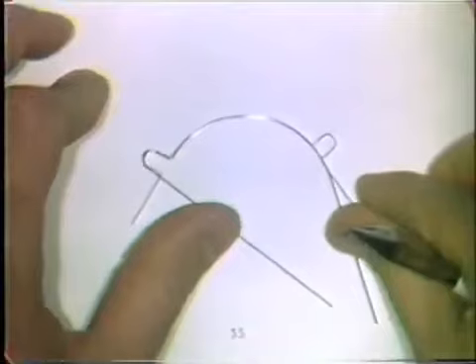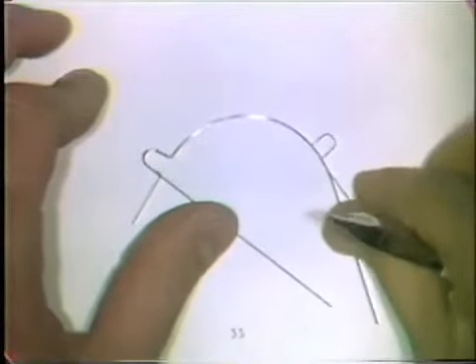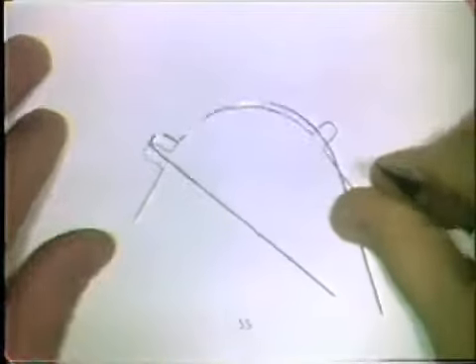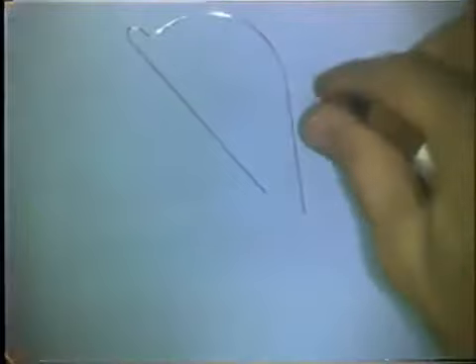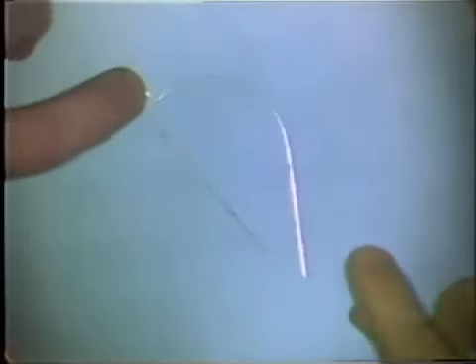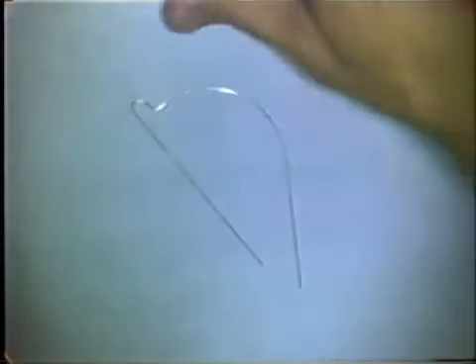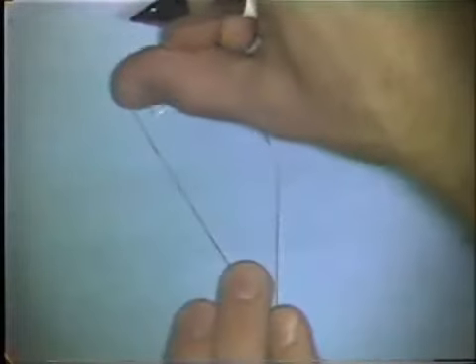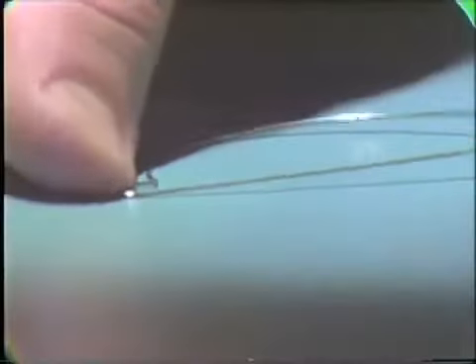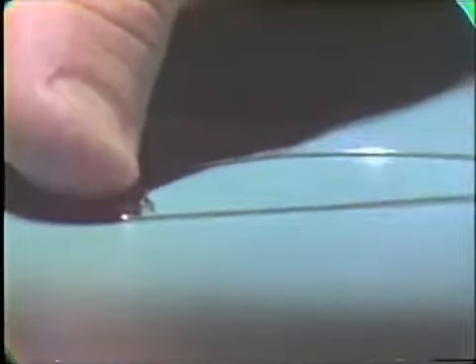Try the wire back on the pattern again. At this point, you can check the flatness of the wire to make sure that the loop and the curve are in the same plane of space. This is done by pushing down on the loop that you've just formed, and you hold the loop on the table surface. And if it rocks, as this wire does, then you know that some adjustment has to be made.